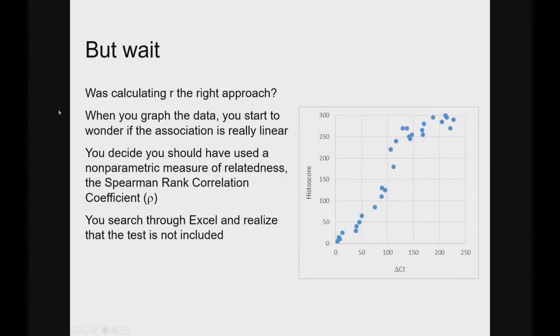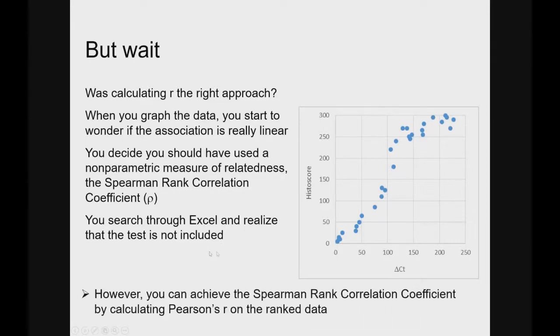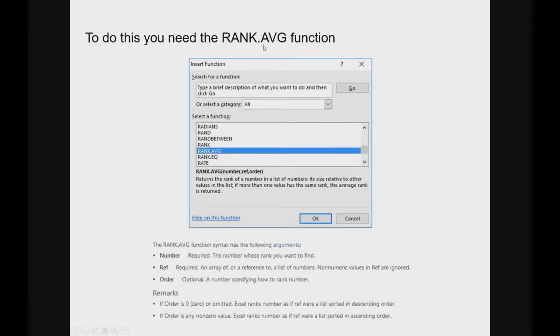Again, this is something Excel can't do, but we're a little bit lucky here in the sense that Spearman's rank correlation coefficient is Pearson's R calculated on the rank data. Now, what's rank data? It's exactly what it is, right? If you've ever watched a golf tournament, and maybe all of you are making the gag symbol right now, how would I ever watch golf on TV? But if you ever have, when they show how people are doing in the tournament, if there's one person at first place and then 3 people tied below him, they give tied ranks to the next one, right? There's multiple people in second place, so we just need to rank our data in that way.